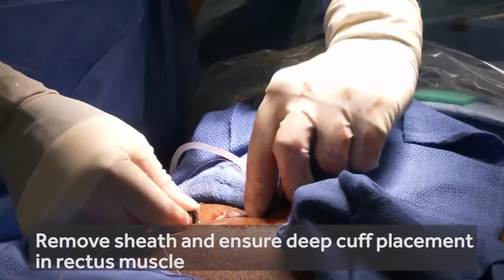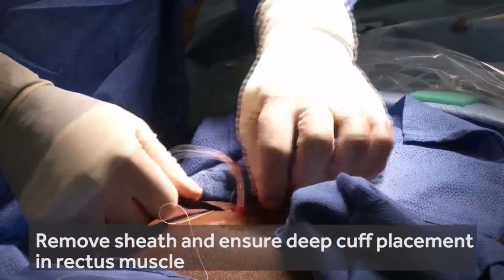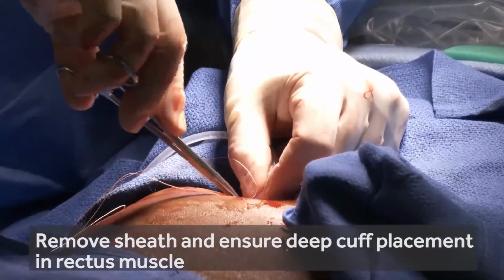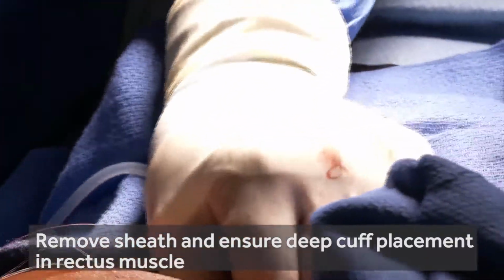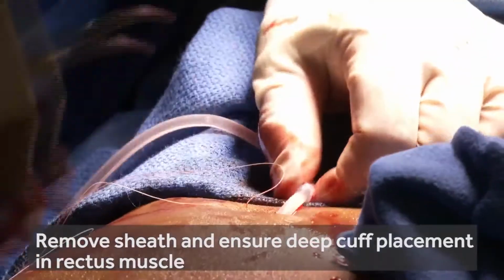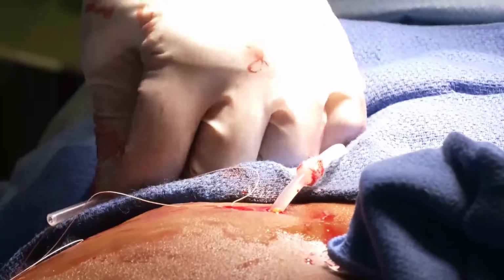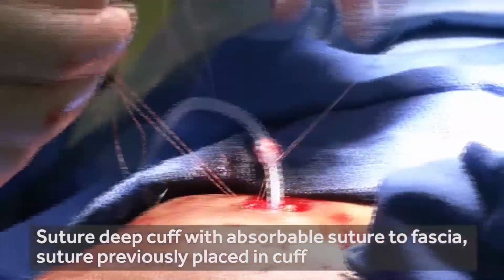You want to be careful when you remove the peel-away sheath that you don't pull the catheter out. So you just do it slowly, re-advancing the catheter as needed. Now advance the deep cuff into the rectus sheath, and the superficial cuff was outside. Now we'll secure that suture in just a moment. We'll tie it down onto the rectus sheath.